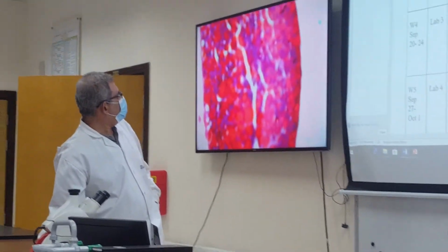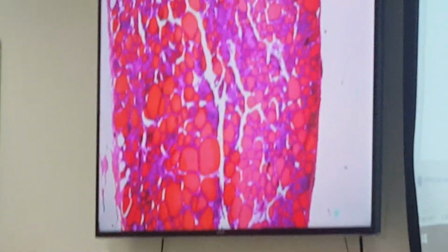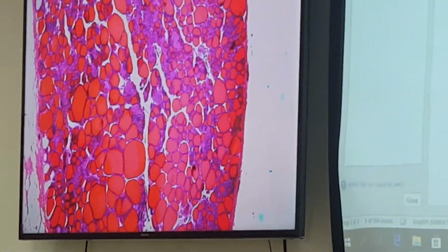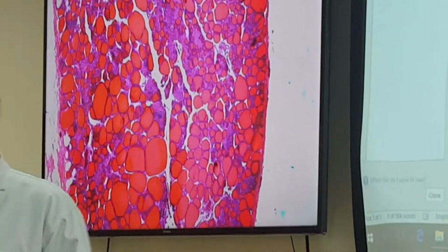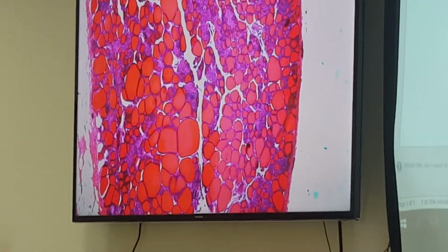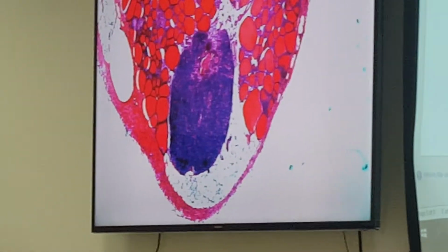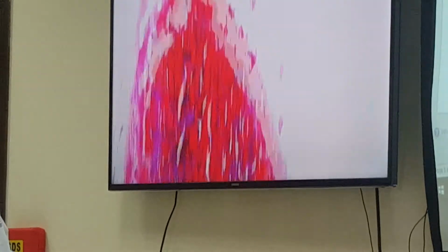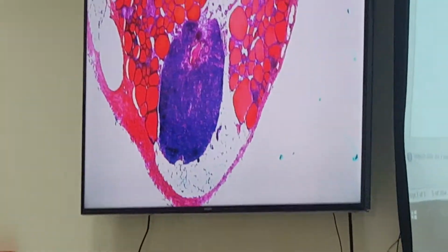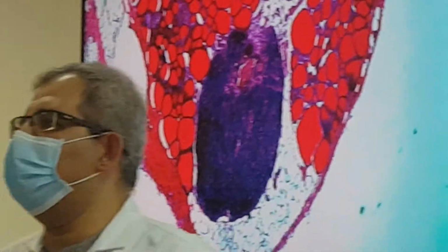So all the time, thyroid and parathyroid glands, they are close relatives. All the time when you look at the thyroid parathyroid gland, they are next to each other. So this is the thyroid and this is the parathyroid, and it's small next to it. Is it this one? Yeah. Okay? All the time. And because it's dense with cells, it will appear like darker bluish color.